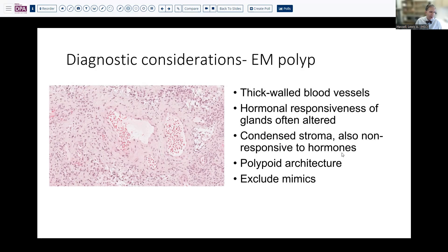The least frequently encountered change is a true polypoid architecture where you can see a three-sided epithelial-lined surface. But if I've got a couple of these features, I will say at least suggestive of or consistent with an endometrial polyp, provided we've excluded the more serious entities that can look similar.